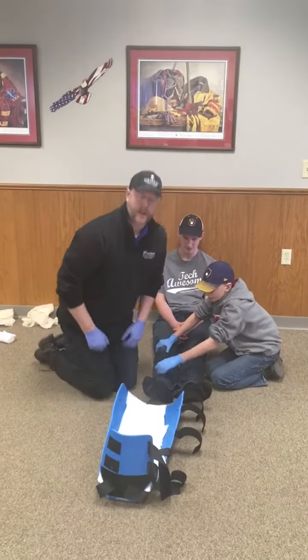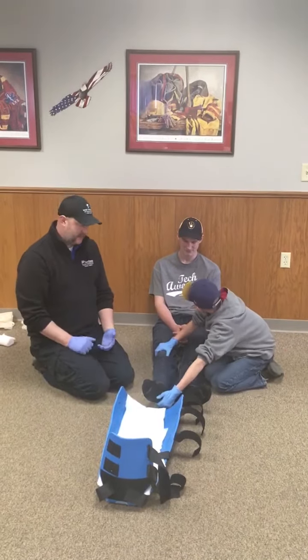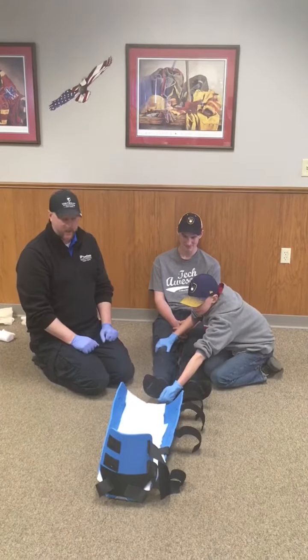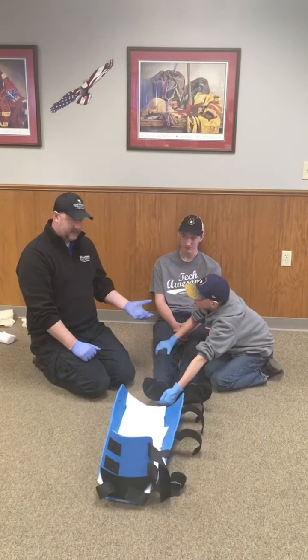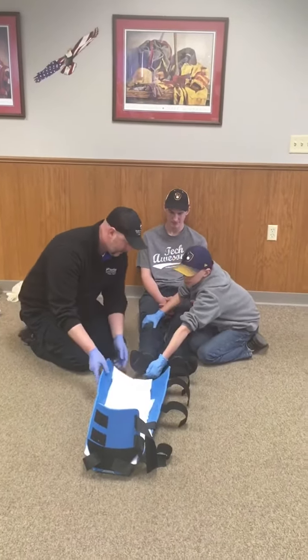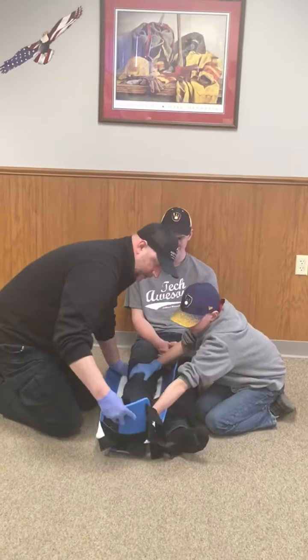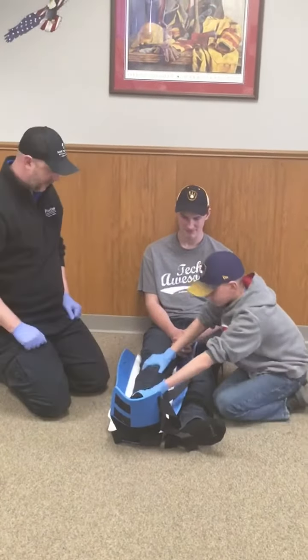To put this splint in place, we're going to have to slightly lift the leg. It's important that your partner lifts the leg as a unit, so communication is key — I'll let my partner know when I'm ready. We're going to lift slightly and slide the splint in place, making sure that the ankle is right in the crook of the splint.